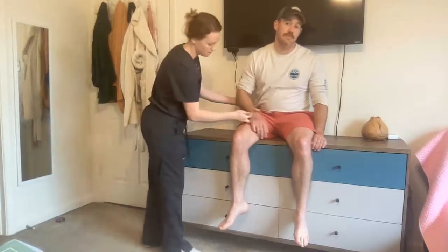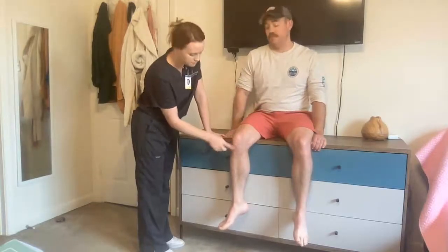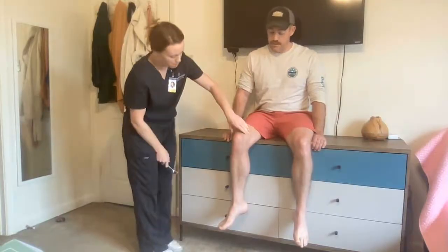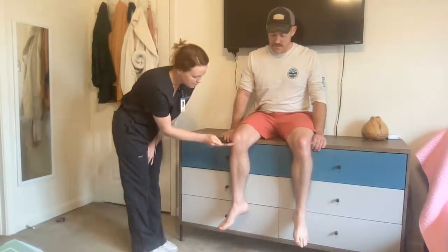Next, the patellar tendon. I want to feel along the kneecap and go right underneath that for the indentation. This time I'm going to use the flat side of the hammer. For the patellar tendon, I want to ensure the leg is dangling and completely relaxed. I'm going to feel across here and tap.